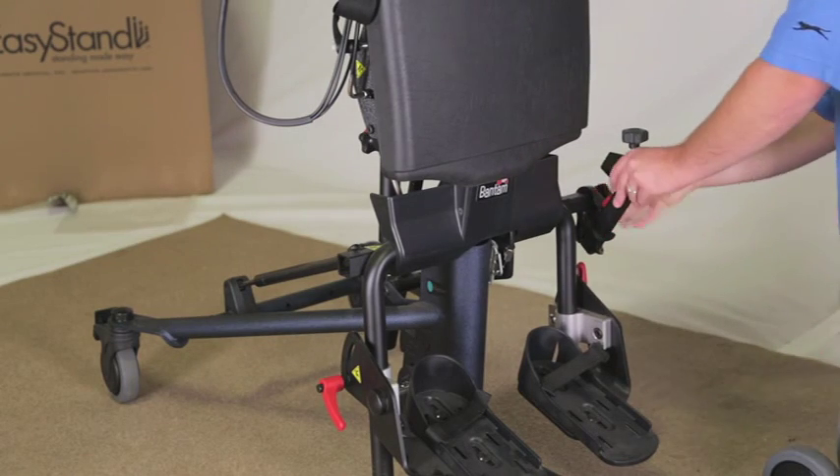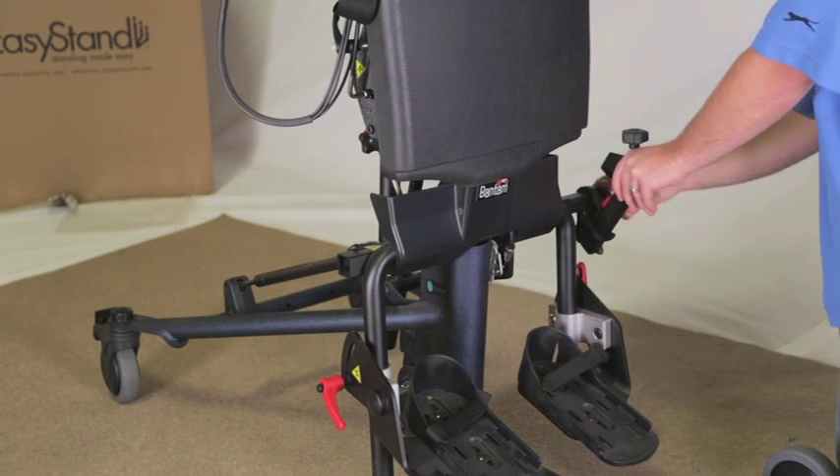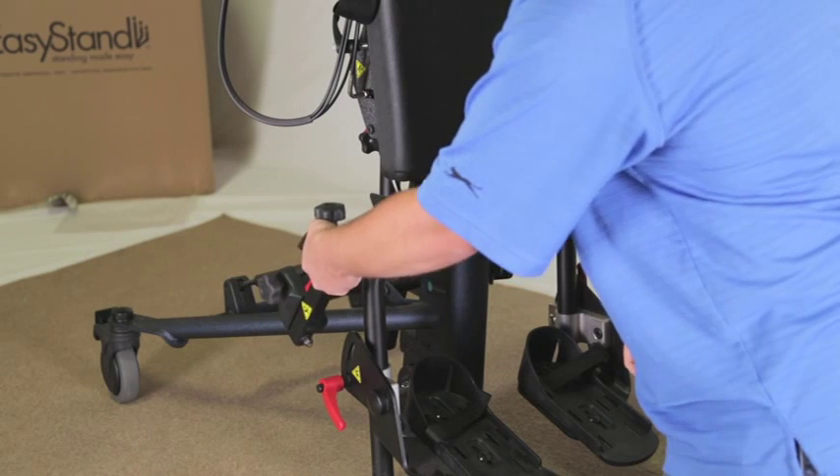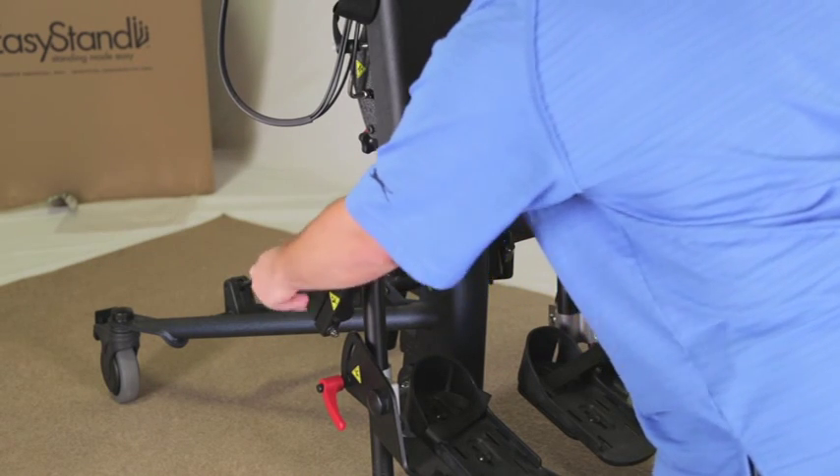Insert each knee bracket assembly into the tube along the seat post. For standard knees, depress the spring button to allow the bracket to slide into place and advance until the spring button locks into place. Tighten knobs securely.